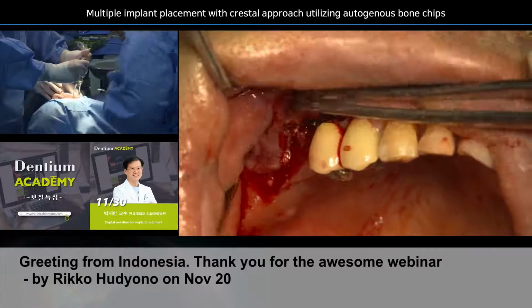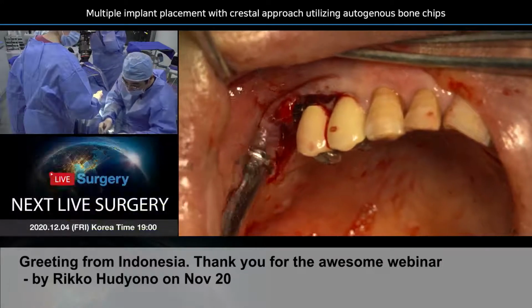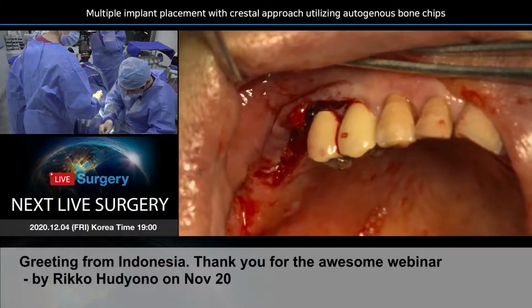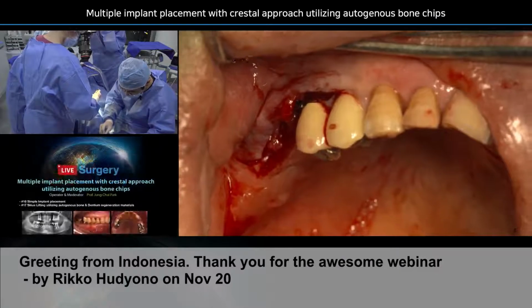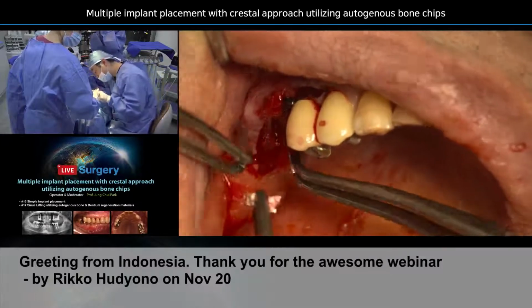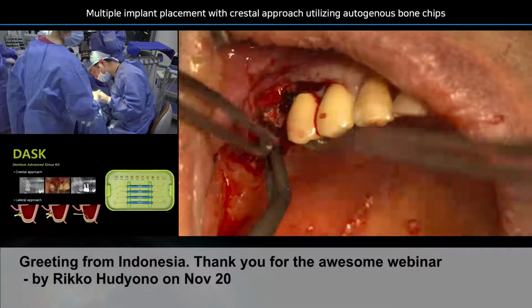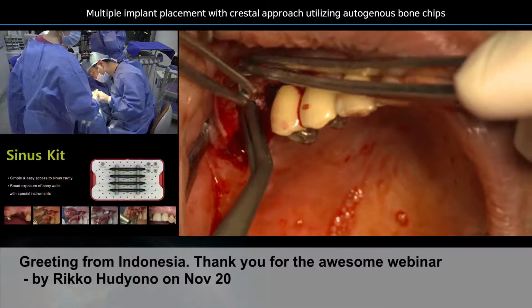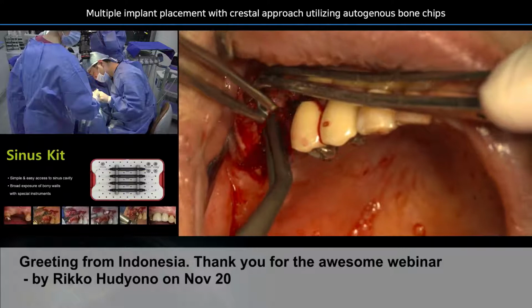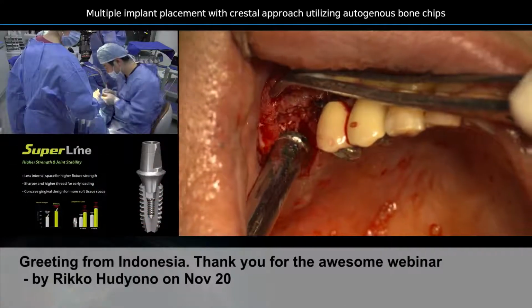Okay, and do the final bone graft here. I'm going to leave a little bit of bone graft because I want to do the additional GBR. As you can see, there is no palatal bone. So this is the main reason that I'm saving a little bit of bone, Osteon 3 collagen mixture with the autogenous bone, and I'm going to perform the additional GBR here. And final malleting here.